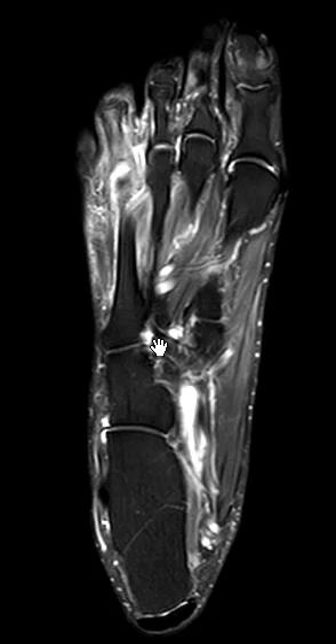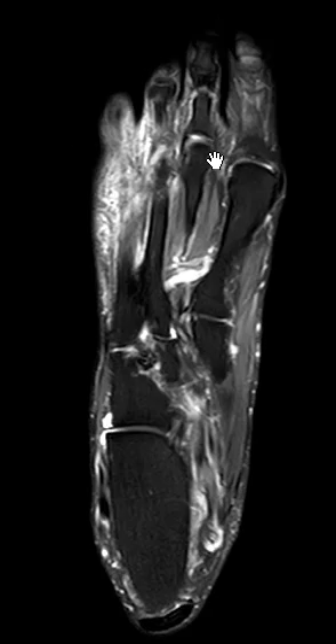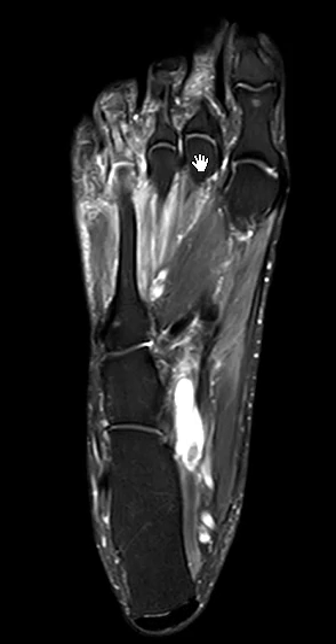Hello, this is Dr. Gay from First Lake MRI. This is a patient with pain in the forefoot, the ball of the foot area. They claimed it was around the second metatarsal head area, but on this view we can see the second metatarsal head looks great.